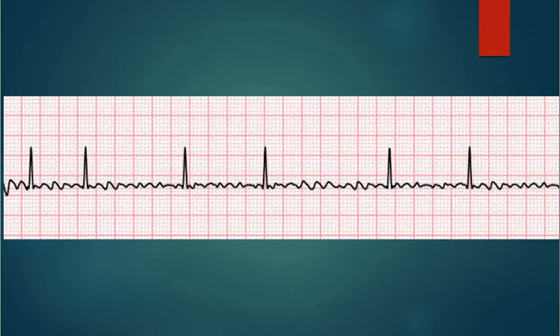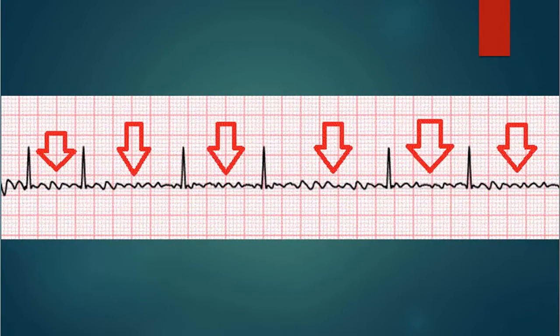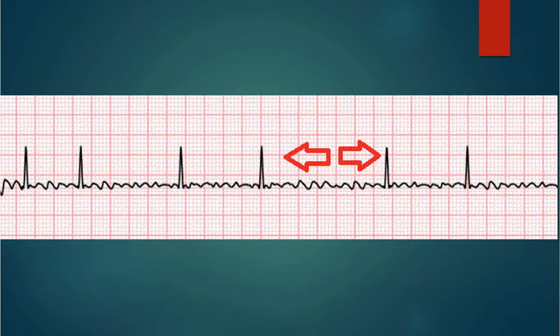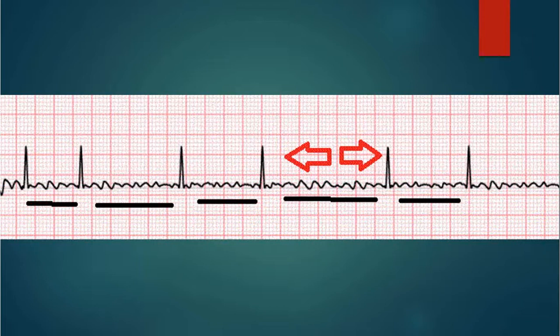Let's have a look at a textbook case of AFib. Here you can clearly see the fibrillation waves in between every complex. Pay particular attention to the length of time between each complex — notice how no two are the same and none of them follow any rhyme or reason. One old trick is to take your six-second strip or longer, fold it over, hold it up to the light, and line up two QRS complexes. If none of the others line up, you're looking at AFib — that's an irregularly irregular rhythm.